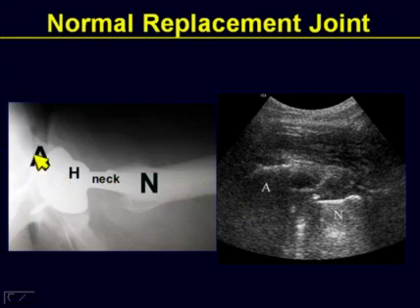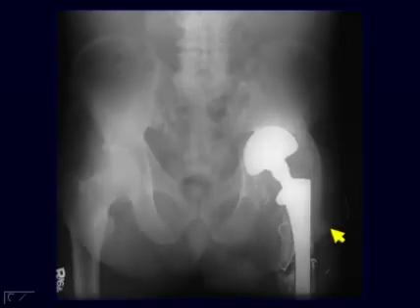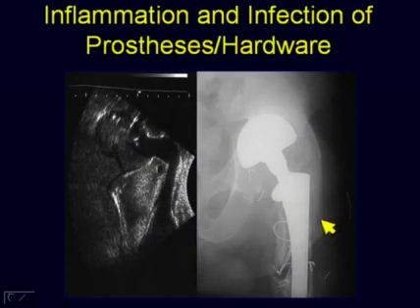So here's the acetabulum and then the metallic head and metallic neck. So you could see the reverberation artifacts of the femoral head and femoral neck. So it is this region that is of concern to us, and that's the site where most of us would sample. And then that individual, of course, would be abnormal, and of course, we need some sampling. Usually it might be infected.